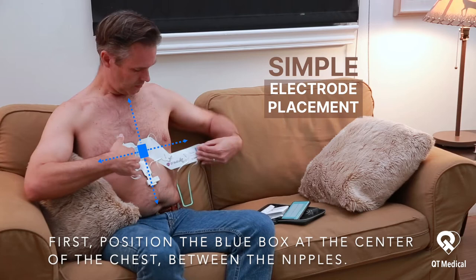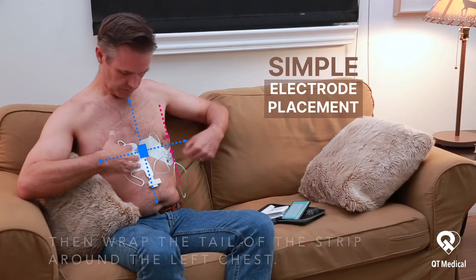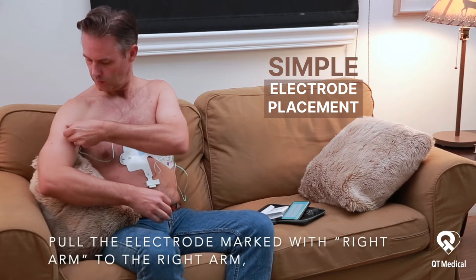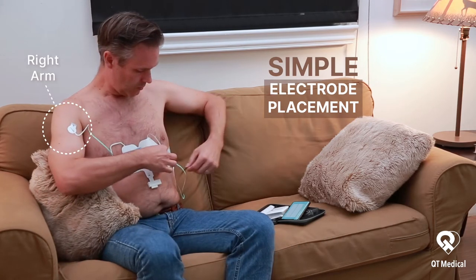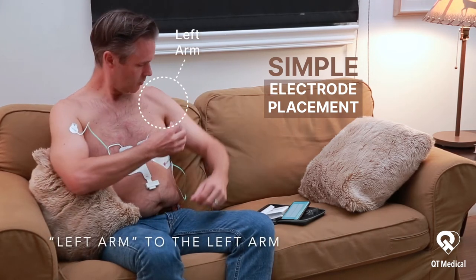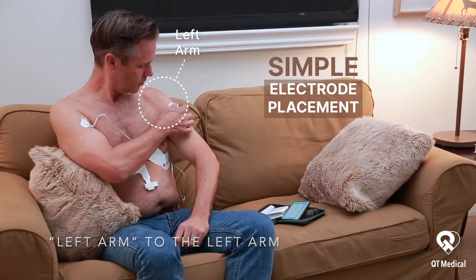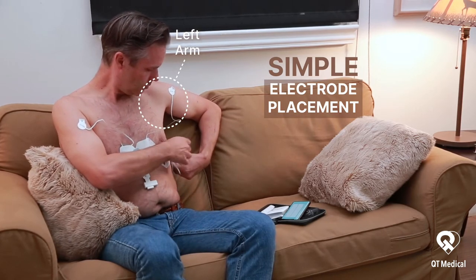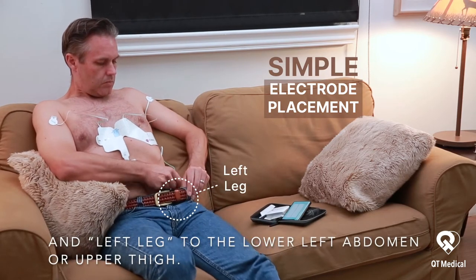First, position the blue box at the center of the chest between the nipples, then wrap the tail of the strip around the left chest. Pull the electrode marked with right arm to the right arm, left arm to the left arm, and left leg to the lower left abdomen or upper thigh.